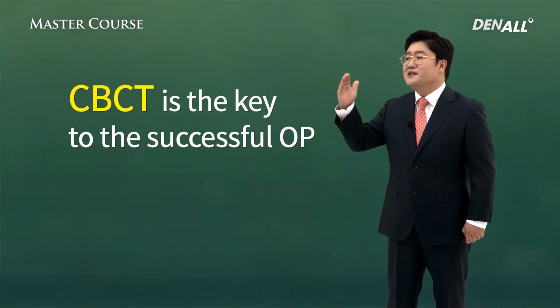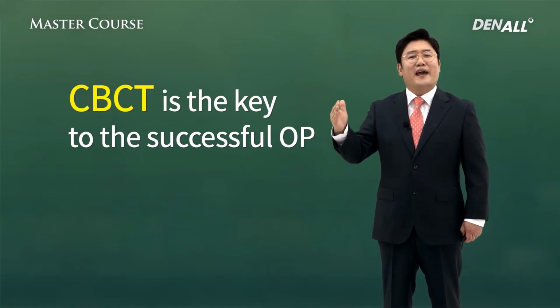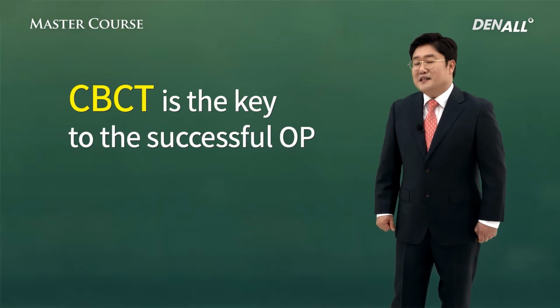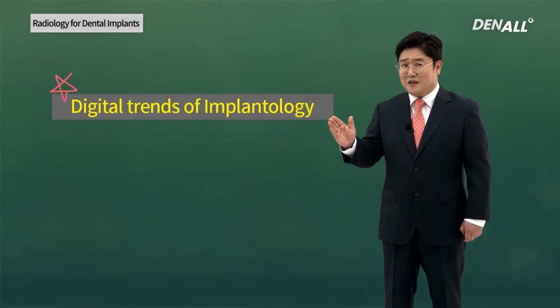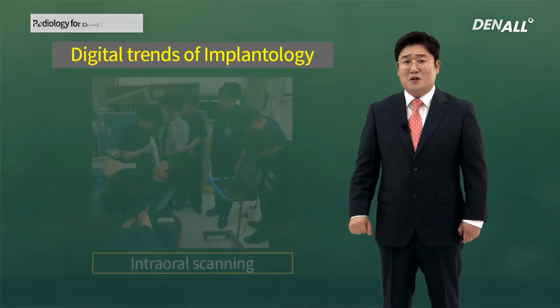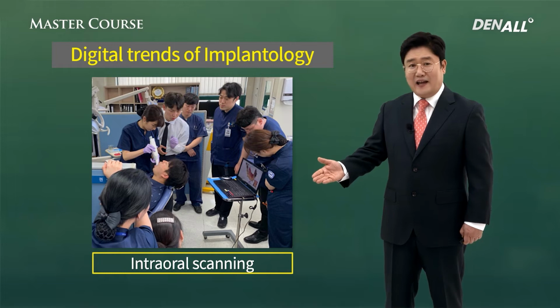CBCT development has led the implantology surgical field as well. CBCT is the key to the successful implant surgery. I can say that for sure. As you know, the conspicuous trend in implantology is digital. If you do not know about digital, you may not be able to join the hot discussions.